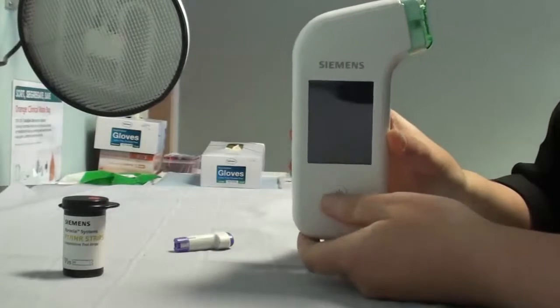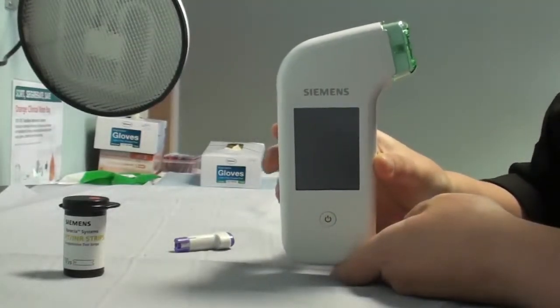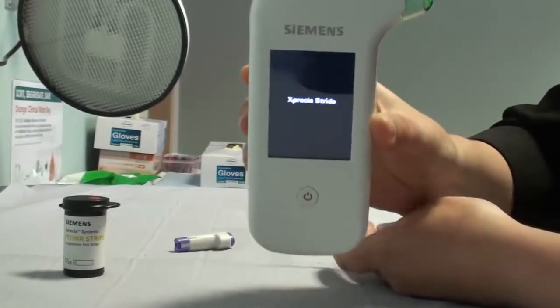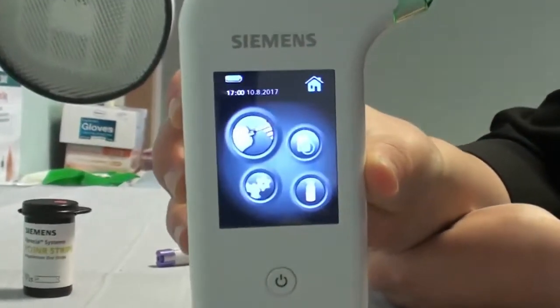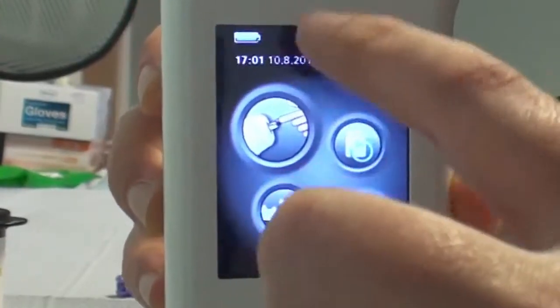So the first thing you need to do is turn the machine on and four icons should appear. The icon that you want to press is the top icon with the finger and bleb of blood on it, just here.